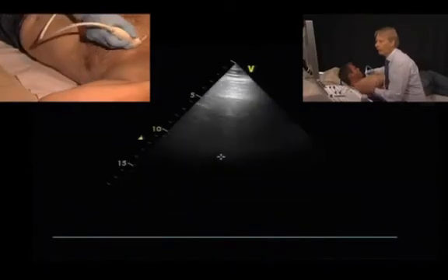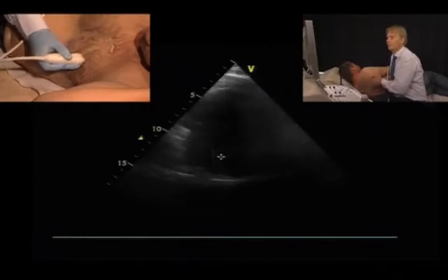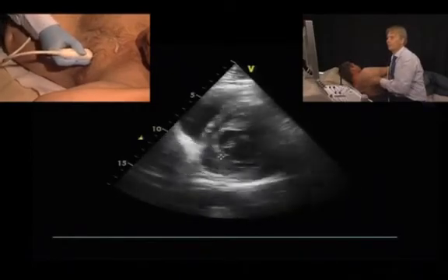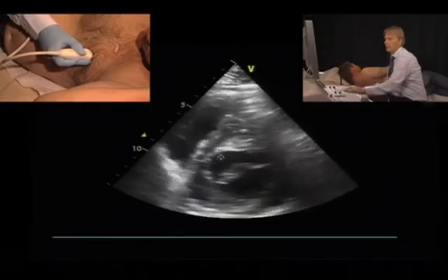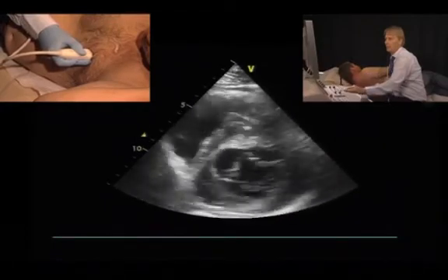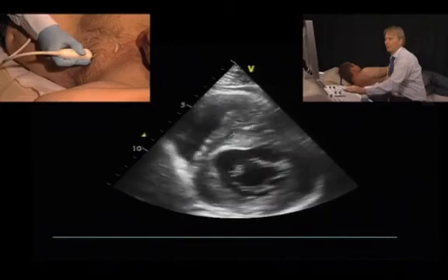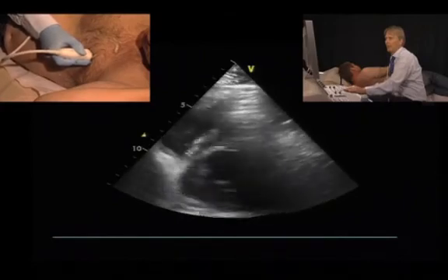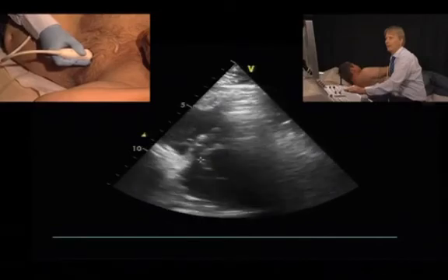And if we take a look at the short axis view, this is the short axis view. This can also be noted here. So, basal inferior septum, wall motion abnormality, thin myocardium. So this is indicative that the patient had alcohol ablation of the interventricular septum to reduce the thickness of the interventricular septum and thereby reduce the gradient.